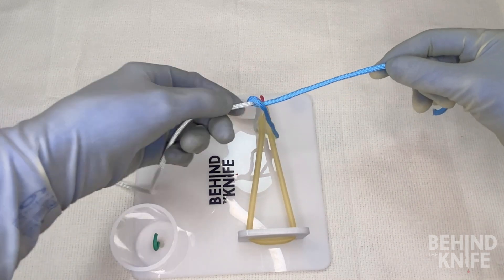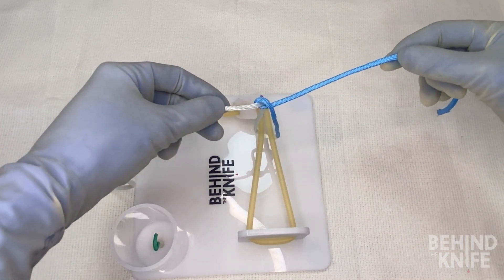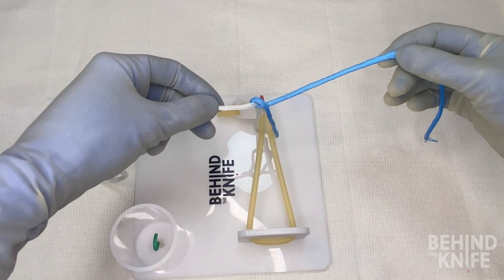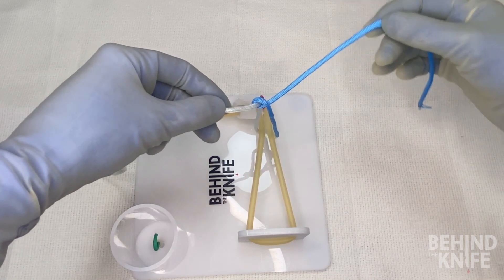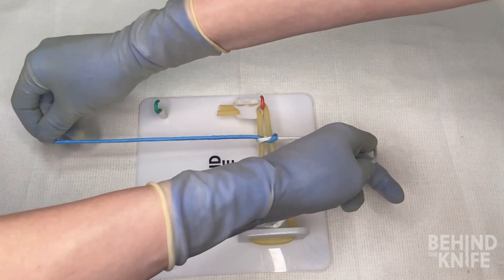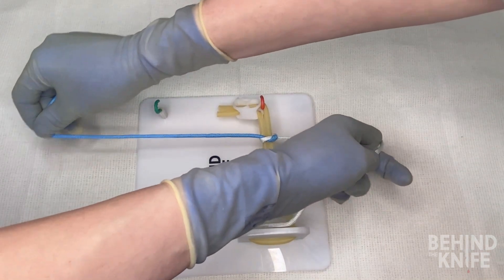Now if you notice, this isn't exactly a square knot. If we didn't cross our strings in the beginning, what we'll have to do is cross our hands here, so I'll cross my hands down to lay a nice square knot.